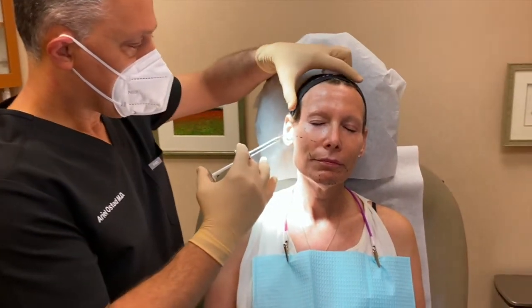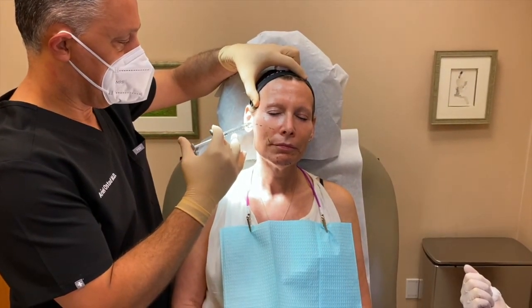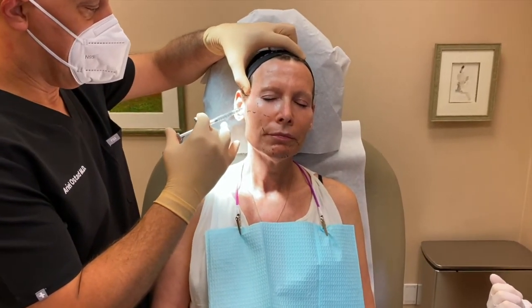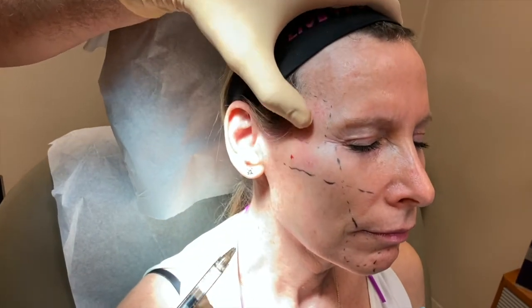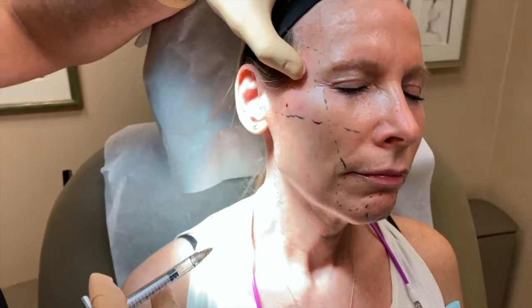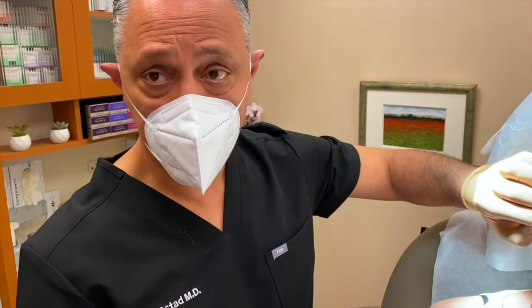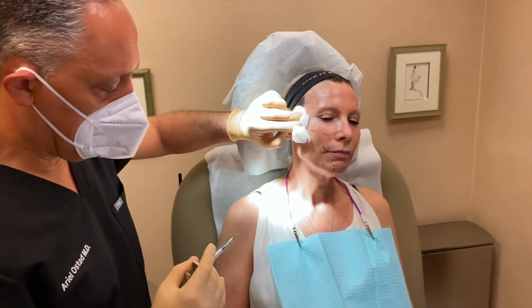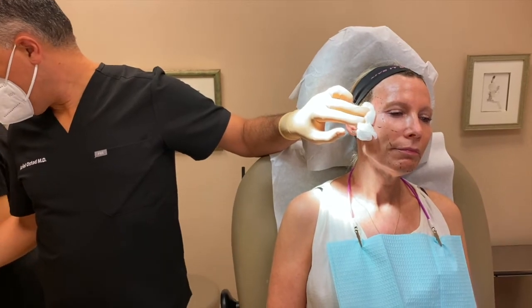All right, so here we go. Just aspirating as we inject. I know the anatomy of the face, so I'm happy that I know where I'm injecting. I'm going to go in her temple a little bit, just put a little bit in here because she's a little bit hollow in here. Okay, and that was, like I said, a syringe in her temple. It was about 0.7 cc's of the syringe in her cheekbone. I did put actually a little bit back in her temple. So now we're going to go ahead and switch over and treat her mid-cheek with a cannula.